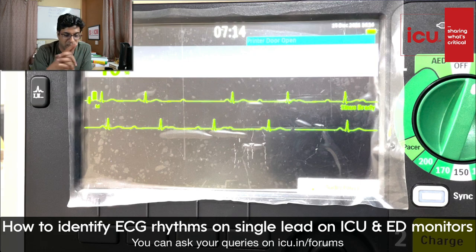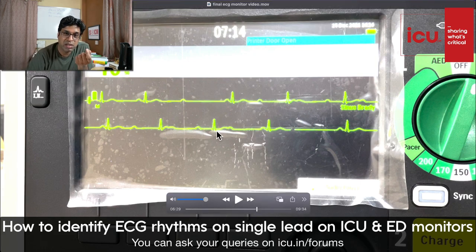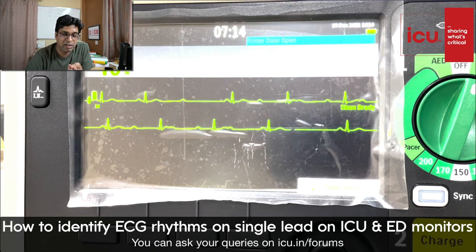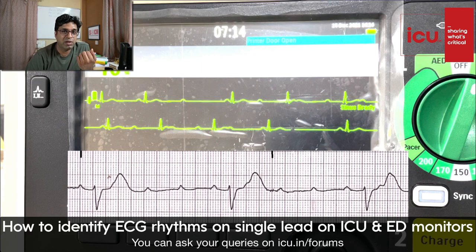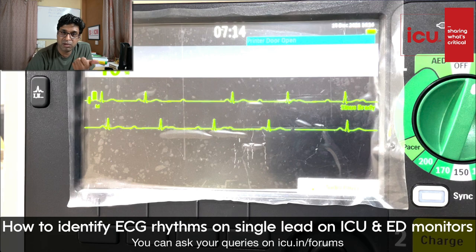I think in this simulator it's not showing properly. Usually in CHB, the ventricle generates its own rhythm. So the QRS is usually a broader one. It's not a narrow complex. Whenever you see a CHB patient, usually the ventricular rhythm is a broad QRS complex. And what is the rhythm of the patient? If we call the consultant, what rhythm are we reporting? The ventricular rate, we need to say, is 35 per minute or 30 per minute or 40 per minute. You will not tell the P wave rate, because the P waves are generating but they are not going to the ventricles. They are not contributing to the contraction of the ventricles. It's the ventricular rhythm which is contributing to the contraction of the ventricles and maintaining the blood pressure. So it's the ventricular rhythm which is being counted.